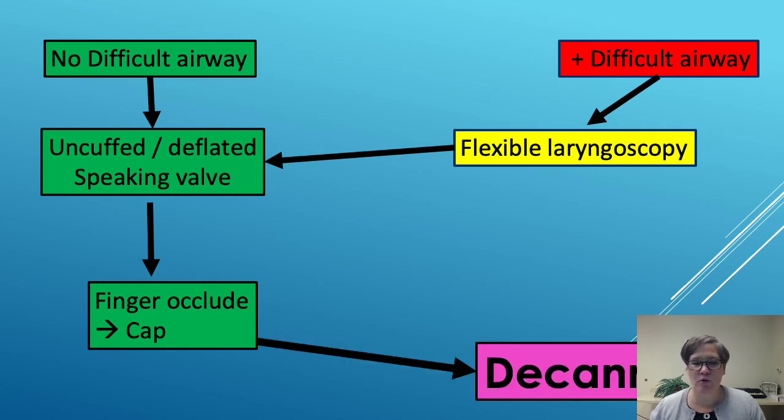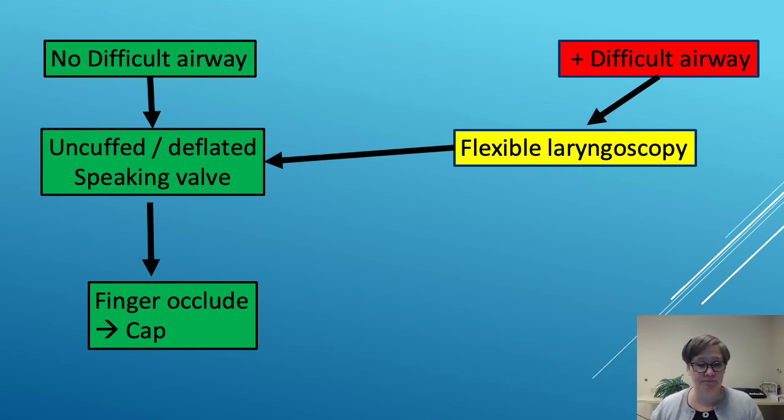And so during that time, we're still monitoring the patient oxygen level and comfort with having the tube capped. In the hospital, it's a little bit harder to do, but you want the patient to be moving around and not just sedentary, because a sedentary airway size is maybe not as great as one that's needed if someone's moving around a lot. So that's something to think about also. The patients need to get up, walking around, that kind of thing.